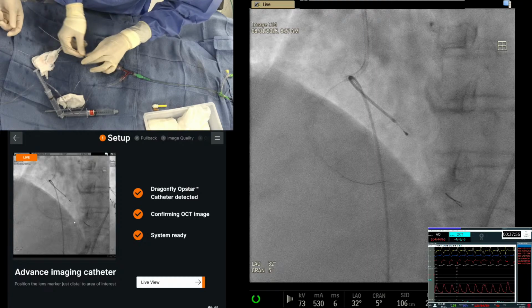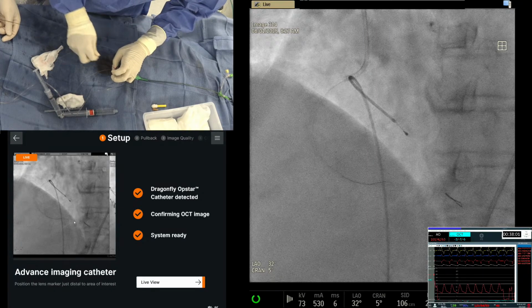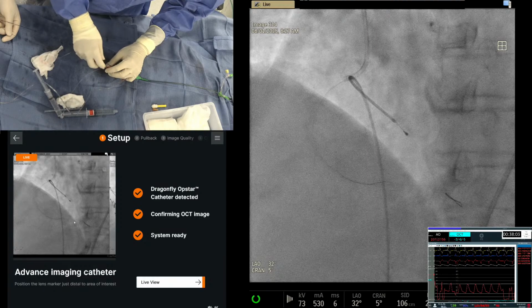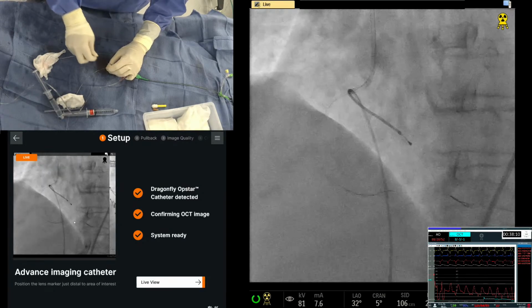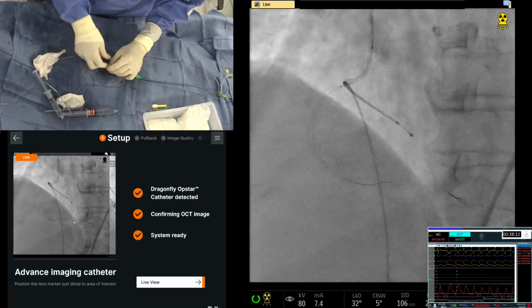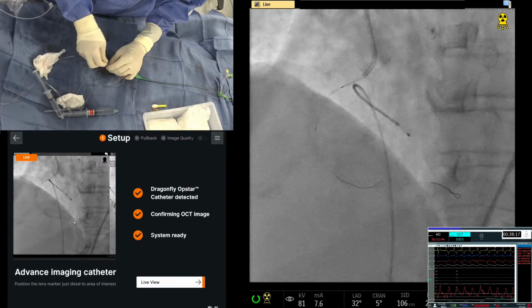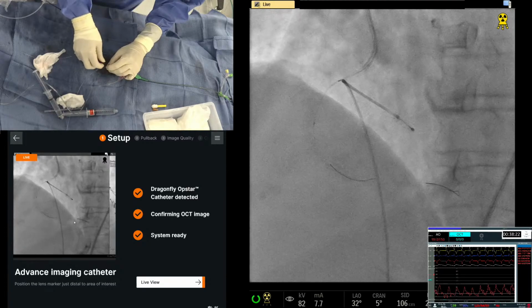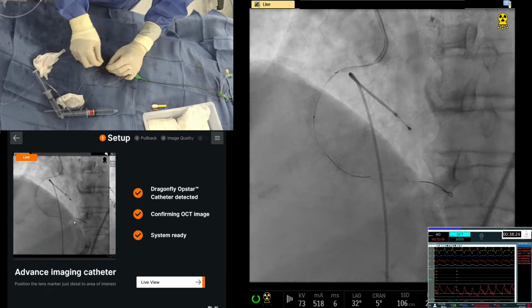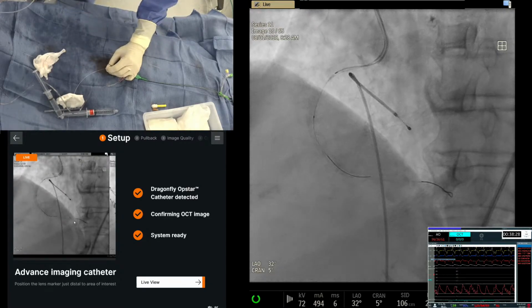If OCT does not go right now on the run through wire, since the Fine Cross crossed, do we still use a 175 burr? Yeah, right. Let us see. You know what I fear? Even if the catheter crosses, it won't pull back well, and we have risk of a VFib then. What do you think?